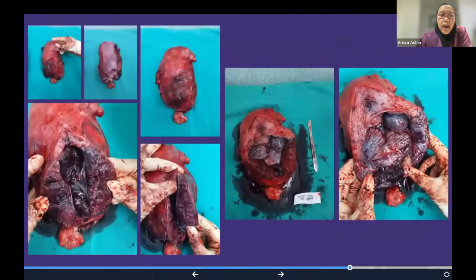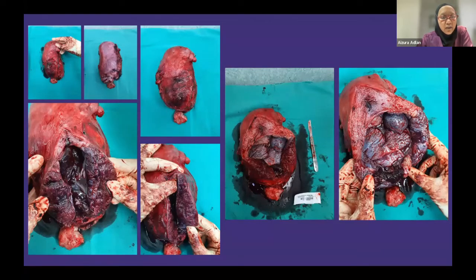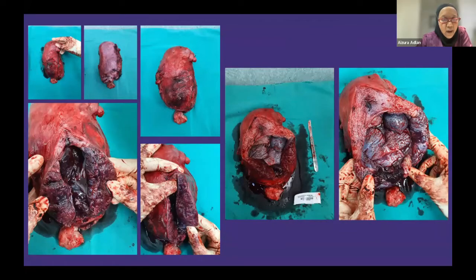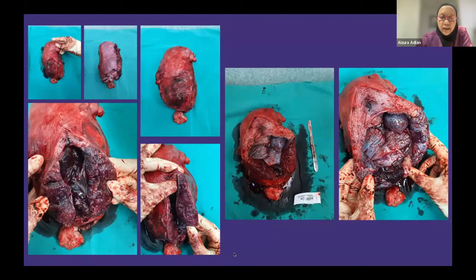This was the resultant hysterectomy. The baby was delivered successfully, but we chose not to save the uterus due to the risk of bleeding. You can see the very thin uterine border and the placenta clearly visible in the specimen.